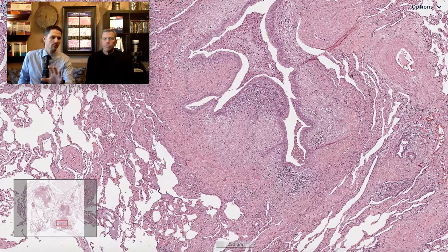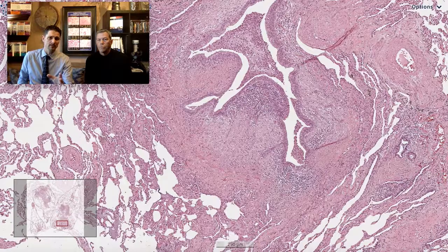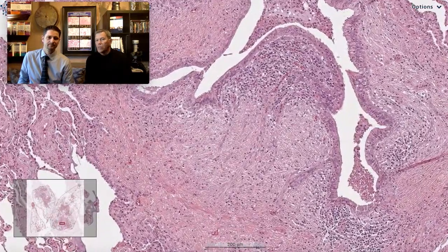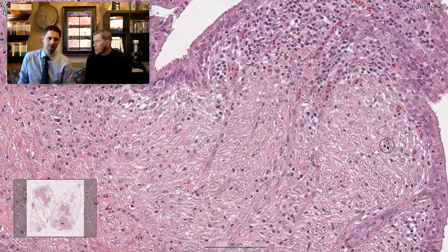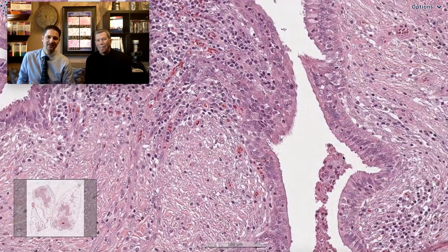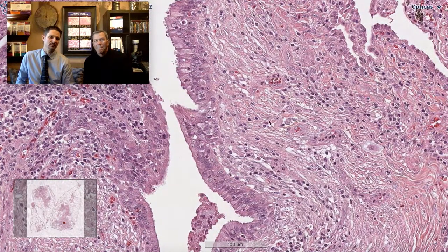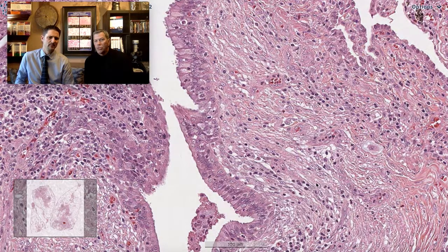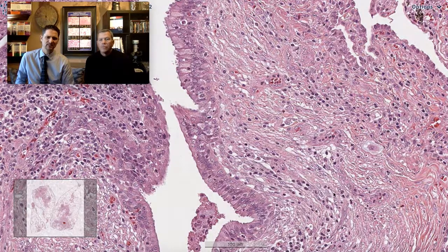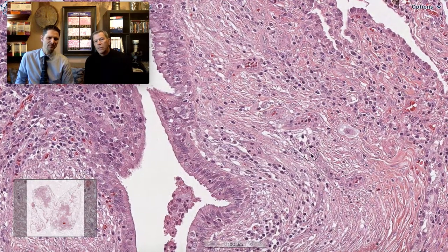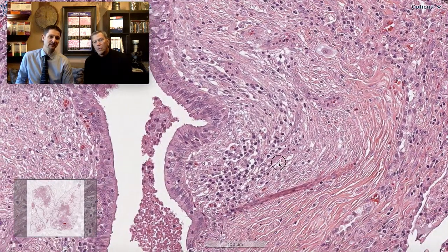Here we've gone to a little bit higher power and we can see this larger airway is distinctly abnormal — time to do a closer look. Right underneath the epithelium, this is not normal submucosa. There's too much stuff — it looks wiry: edema, wiry collagen, inflammatory cells. This is distinctly abnormal.